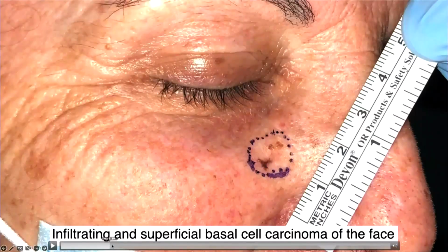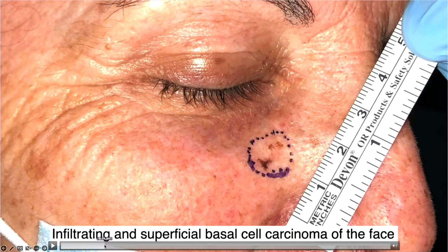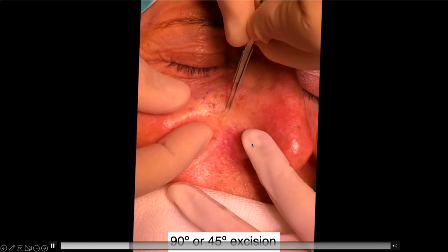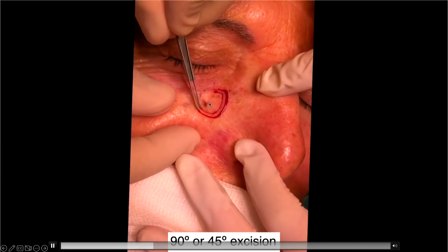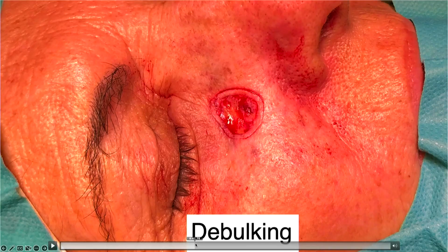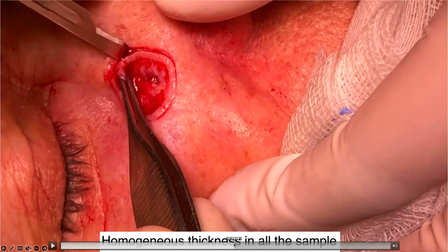And I'm going to show you a little bit how it works. So I'm going to show you a real case. We use this double scalpel to remove the tumor. And you are seeing here, for example, we do this in an infiltrating and superficial basal cell carcinoma. So we're removing all the periphery. Why are we doing this? We published this, because if we use this double scalpel, it's easier to flatten the tissue and to see it in the device. We do the debulking, then we excise all the specimen. I'm going to pass it faster here.